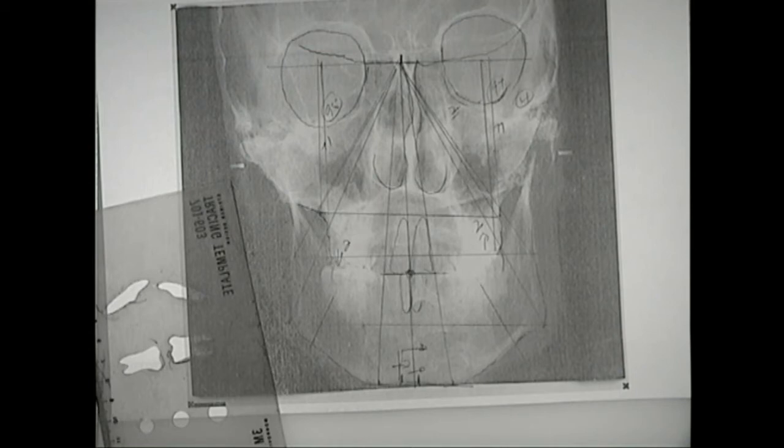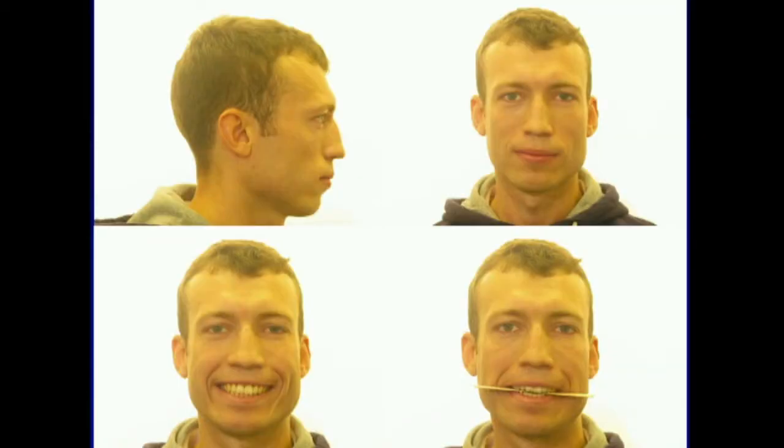So I would do the maxilla, make sure that it's in good position, do my measurements, my model surgery according to these. Now remember that this 97 is not going to be the same on the models. But when I do my model, I articulate the models, I measure the vertical distance to the ring of my articulator, like there, and I see it must be very close to the 2. Then I do that surgery, and then I make an intermediate wafer. Once I've done the maxilla, in this case, I would.